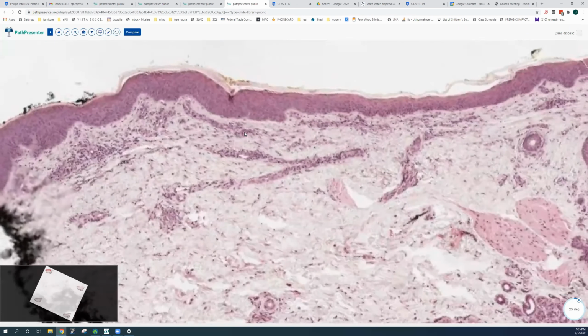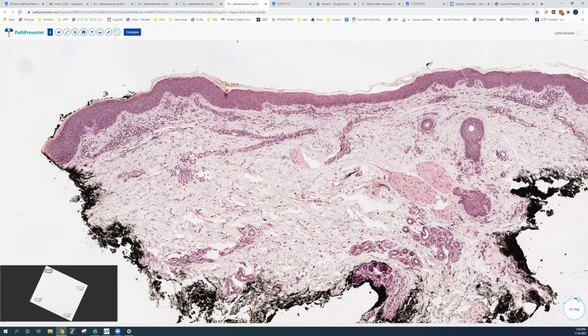Actually, this is a pretty different stain from the one we use in our lab. You can tell that there's a lot less pink in it, so there's a lot less eosin, so it's hard to find the eosinophils if there are any in here. And then the plasma cells, I'm not going to get a little higher magnification than this. So it's going to be hard to point out the plasma cells.